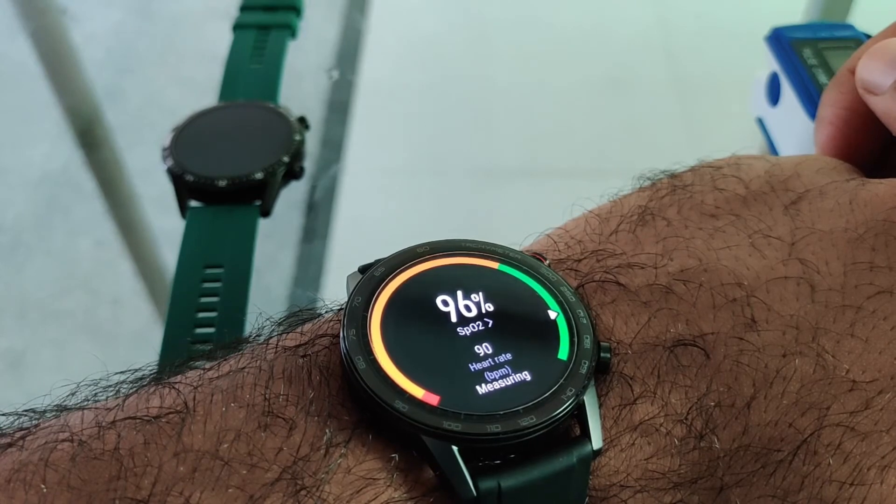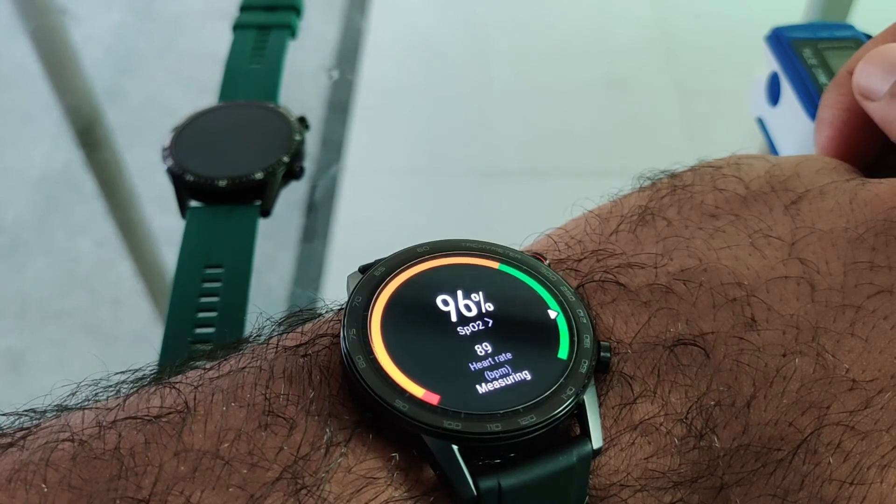Let's try that one more time and check the oxygen levels again, because I am somehow not convinced with the given results.